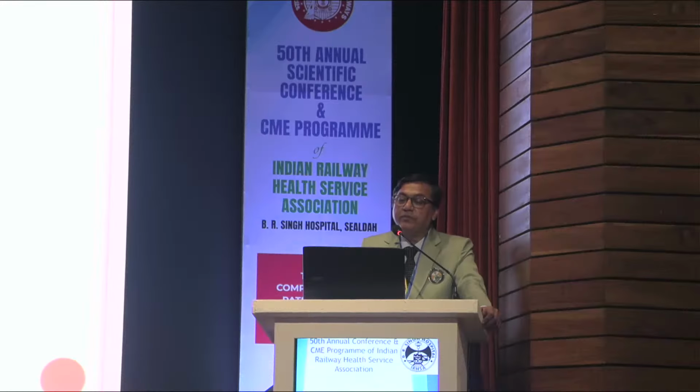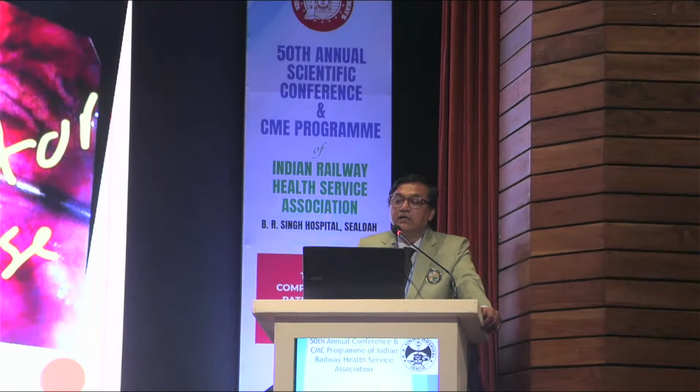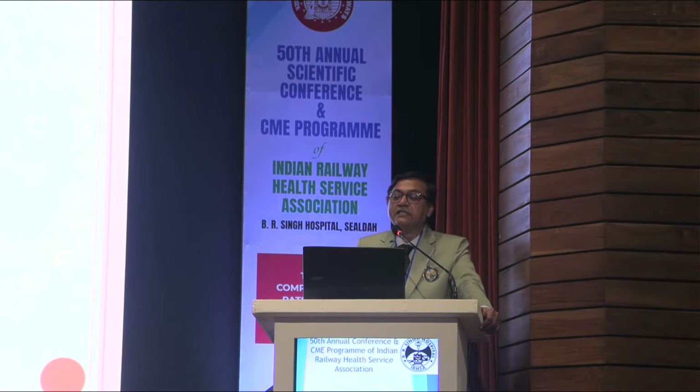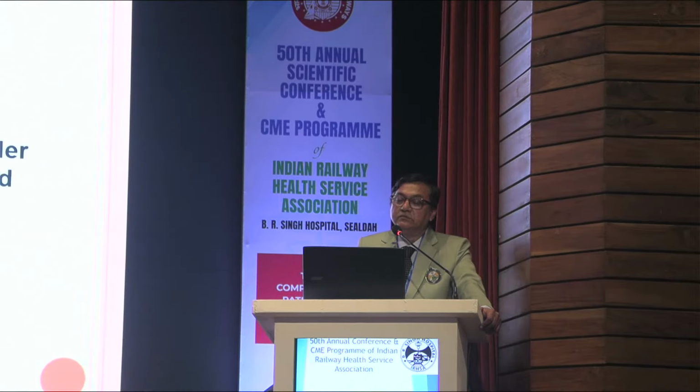This is the fibroid being taken out with the help of a myoma screw. This is the suturing that we have done, intracorporeal suture. That was a very unique thing to be done at that time. Maybe it was done 15 years back. And the tissue is being retrieved by morcellation. And this is the tissue we can see in the kidney dish that we have removed. It was quite a large fibroid, and the patient had a good recovery.